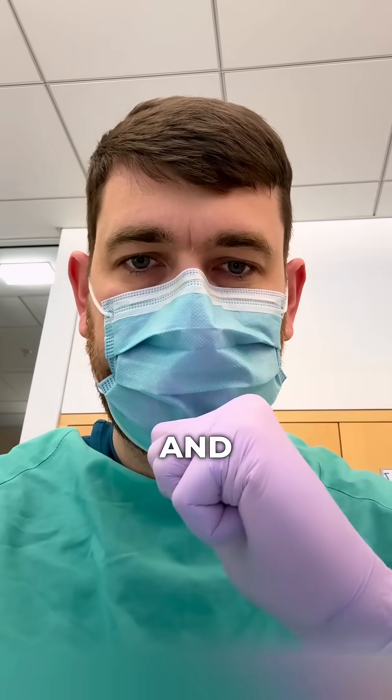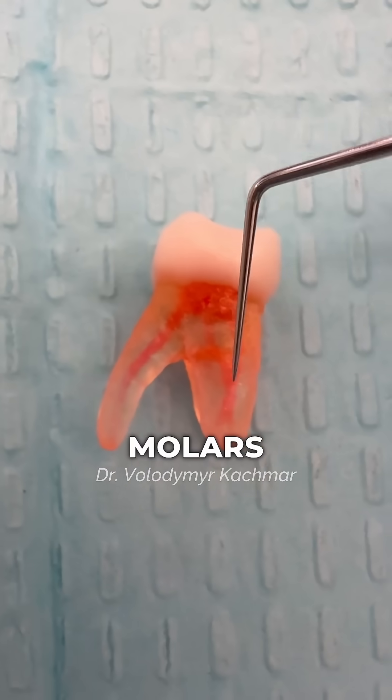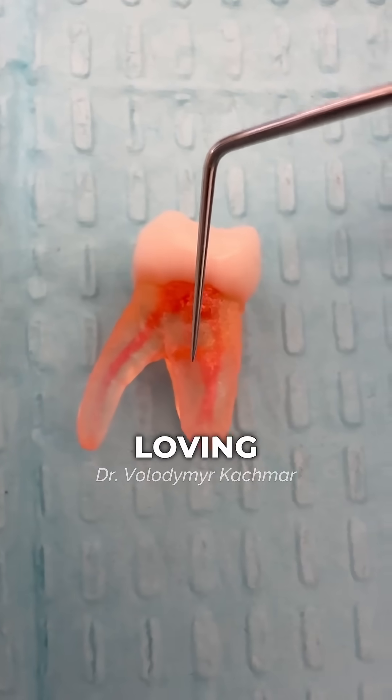MB2: the easiest way to find and clean it. After this video, you will never be afraid of upper first molars. Maybe you will even start loving endo.